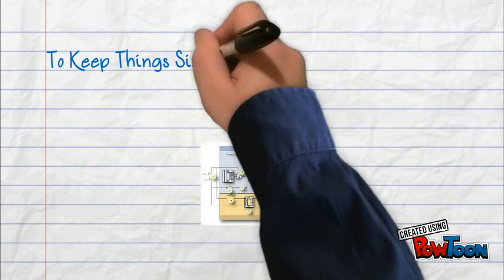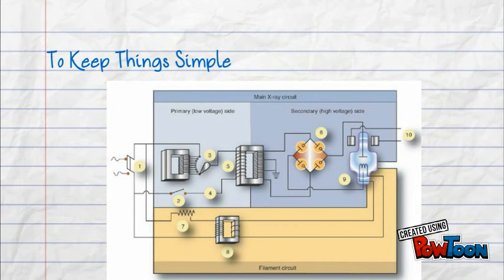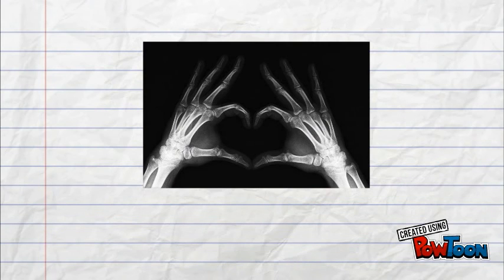To keep things simple, the filament circuit directs the electricity to the X-ray tube on the cathode side. The filament gets heated, the electrons are boiled off, and then X-rays are produced.